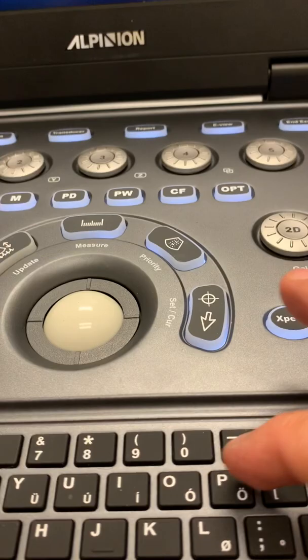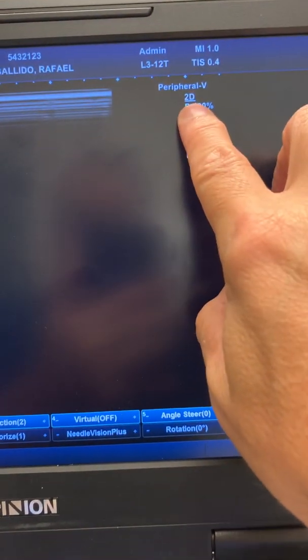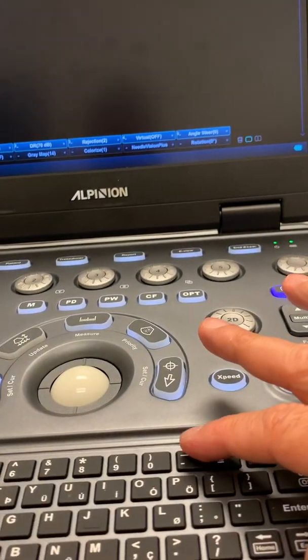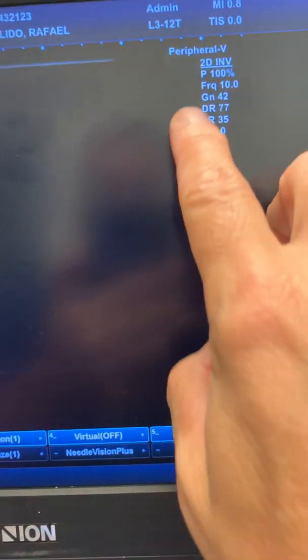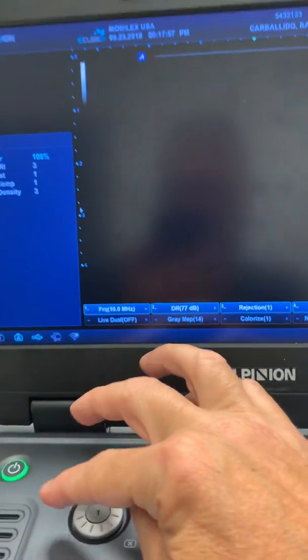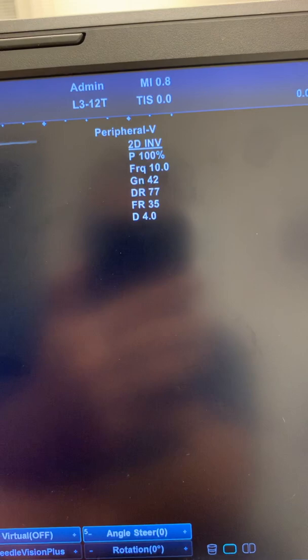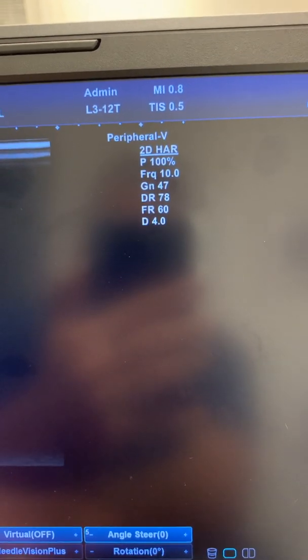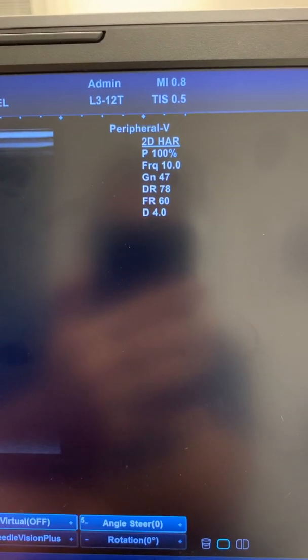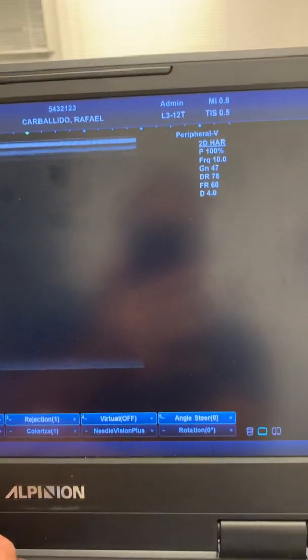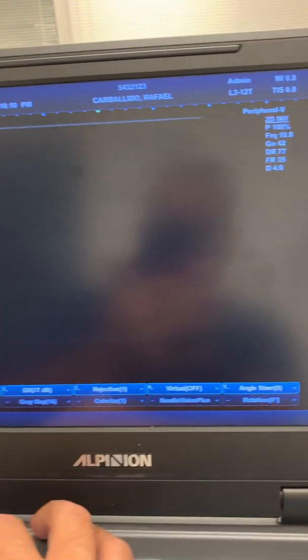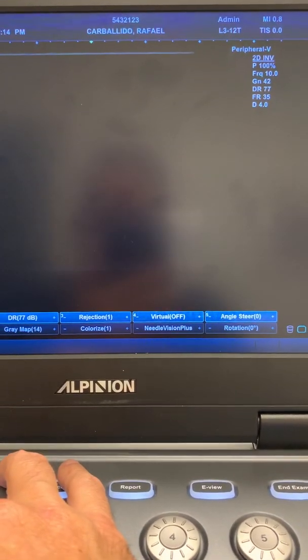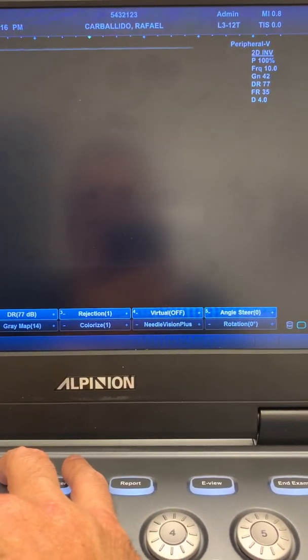When you click zero it goes back to 2D fundamental image. When I click zero again it goes now to INV inverted harmonic. If I rotate the knob here you will see how it changes now to H A R which is the regular harmonic imaging. If I rotate again then it will go to INV. Those are the two types of harmonics that we have in the Alpinion E cube i7.